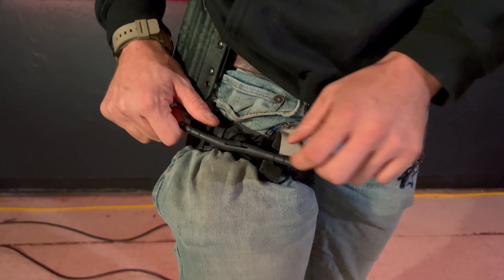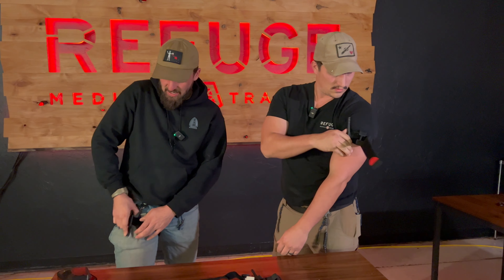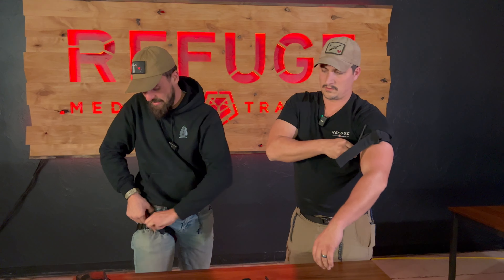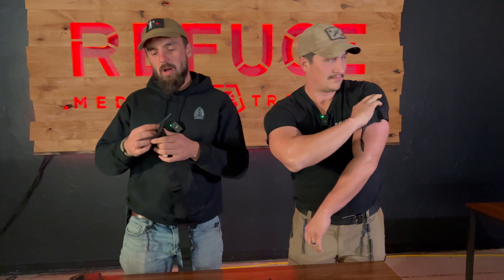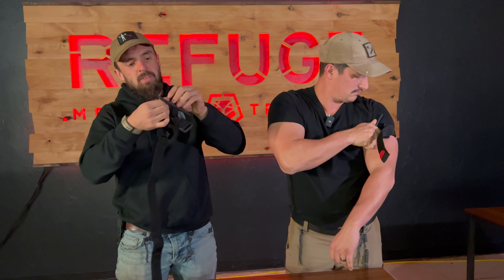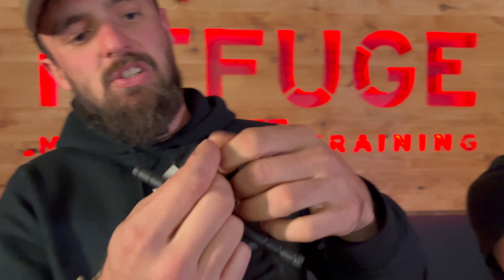I'll apply the fake one over the arm here. I'm just now getting restriction, and the windlass is starting to bend. You can see the windlass starting to contort right there in the center. There's so much slop. What I've seen happen a lot of times is that the Kevlar band inside these supposed tourniquets will actually rip right out from the windlass itself in the pulling process.